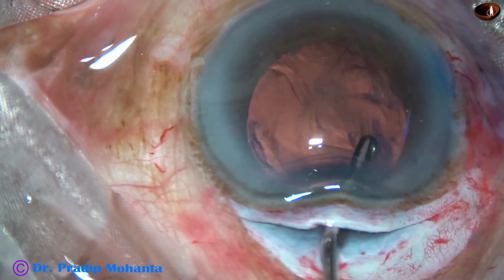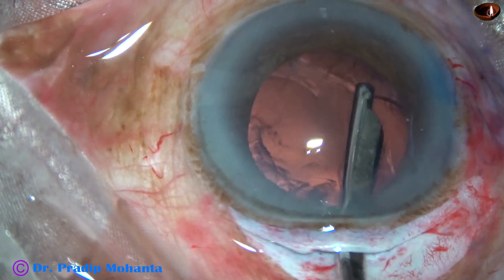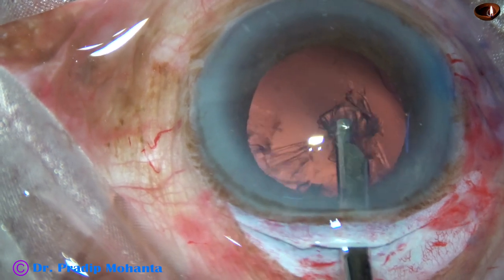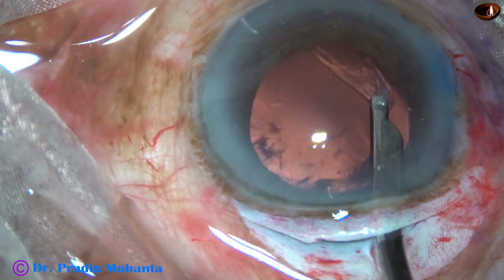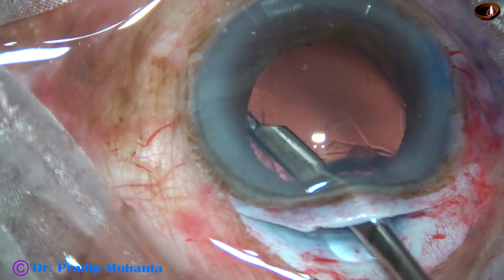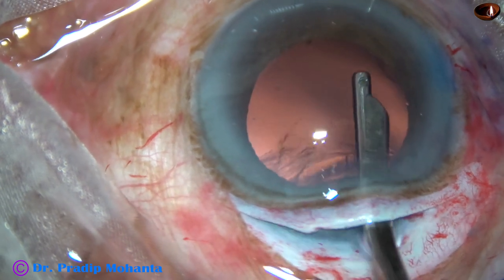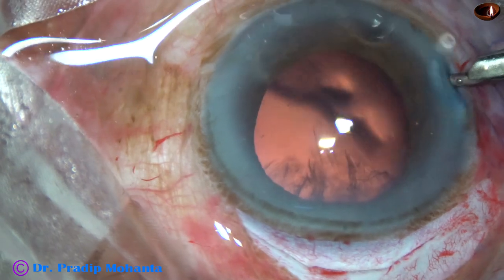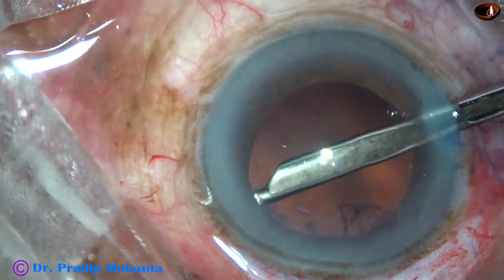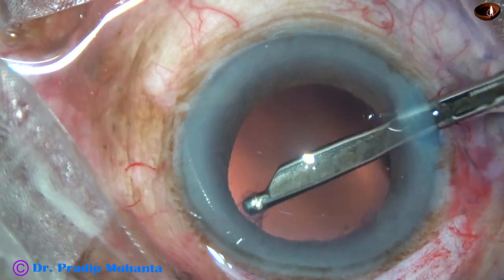And now I am going to remove the cortex. Very nicely, the cortex is being removed by a 22-gauge Simcoe cannula. Now I go through the side port at 8:45 o'clock and remove the cortex from the upper part.